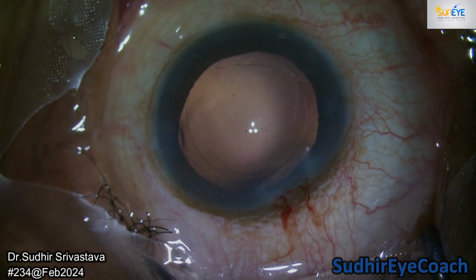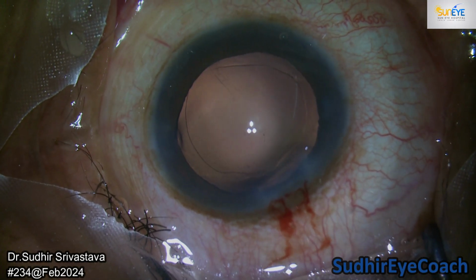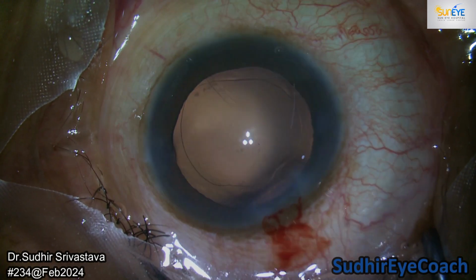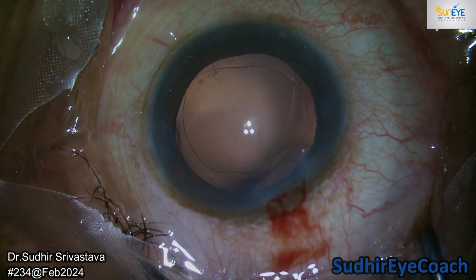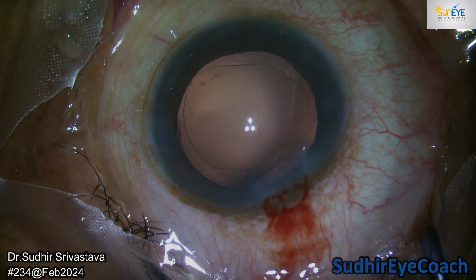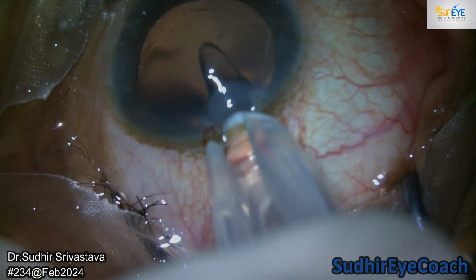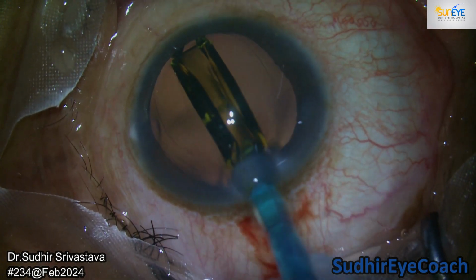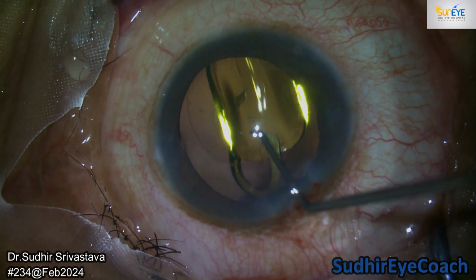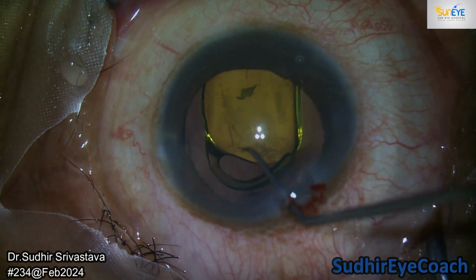Sometimes I even go into the equatorial area and flush the BSS, and the cells present in the equatorial area, or sometimes hidden cortex, also move out, and the aspiration becomes easy. It obviously reduces the possibility of posterior capsular opacification, or it can delay it.